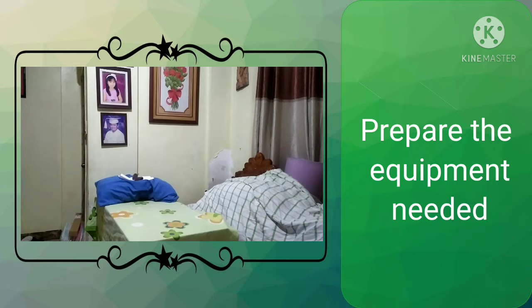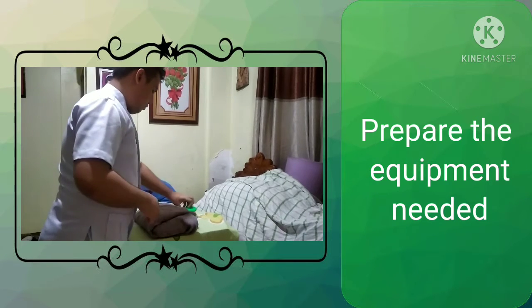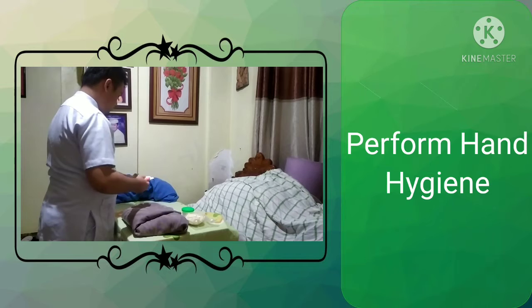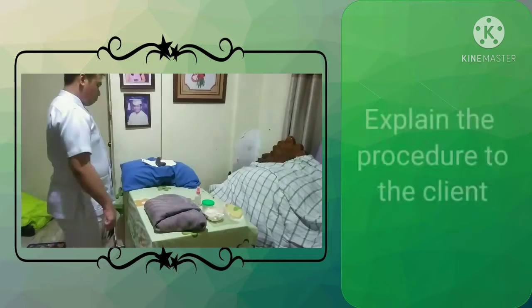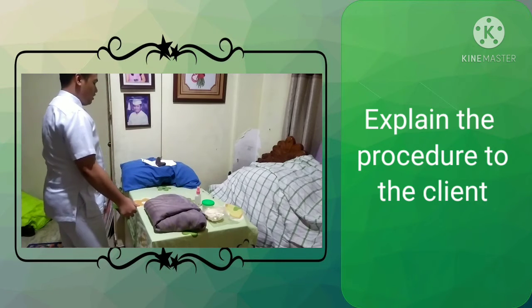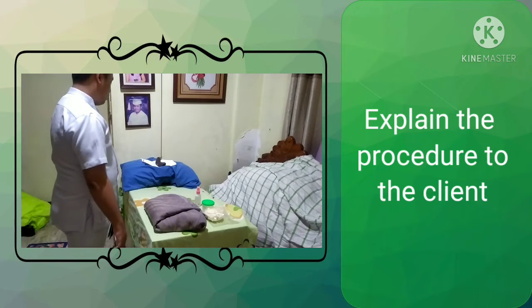For the procedure, first is to prepare the equipment needed. Next is to perform hand hygiene. Explain the procedure to the client. Hello po, magandang araw. Ako po si Nurse Jed, ang inyong pong nurse ngayong araw na ito. Pwede kong malaman kung anong pangalan po ninyo?